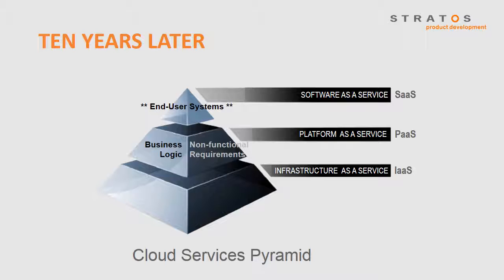And finally, we come to infrastructure as a service, also known as IaaS, which provides access to hardware and computing resources like virtual machines, storage, networks, and message queues. This level gives you deep control over configuring and monitoring cloud resources. Now that these service layers are well documented and developed, cloud services have really come a long way, which is great because otherwise you couldn't consider them for use in your medical device system.